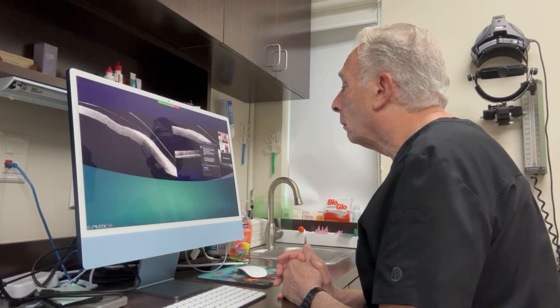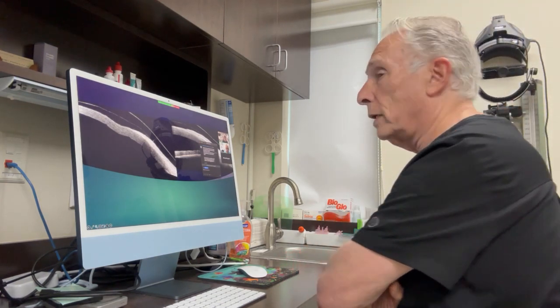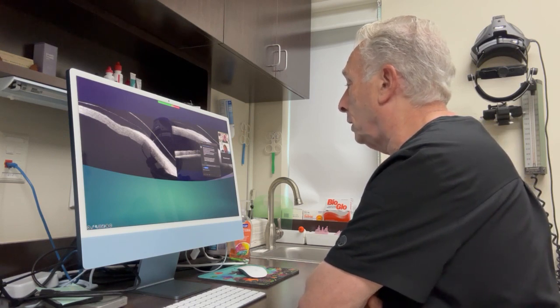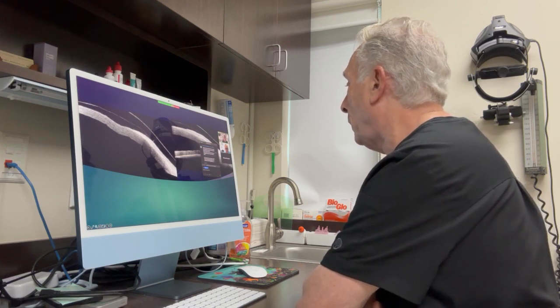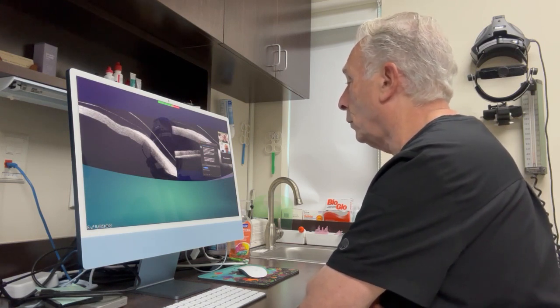We have a third question from Dr. Wazani. Do you think that the future of scleral lens fitting will be guided by artificial intelligence? Wow, that's a great question. I think that's a possibility, where artificial intelligence will tell you, based on the parameters we're looking at, the corneal thickness and the diameter, what might be the best type of lens design for that patient. Maybe. I think we're a long way from that, but who knows? Great question.